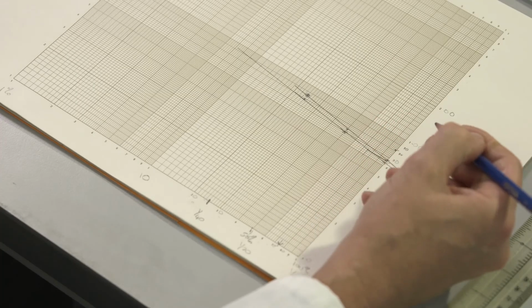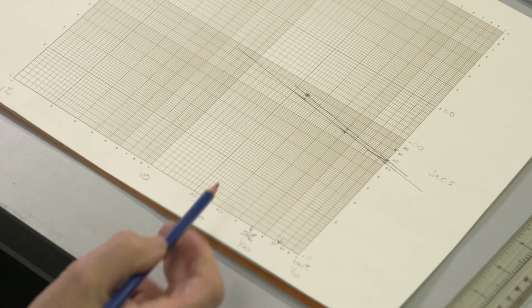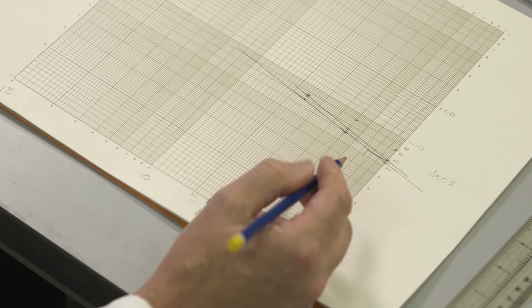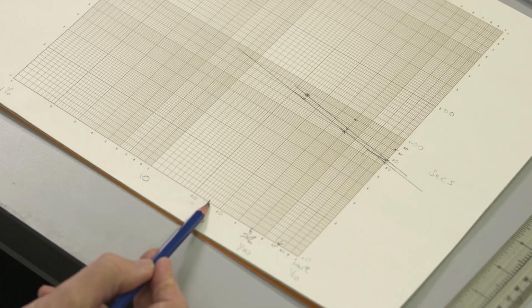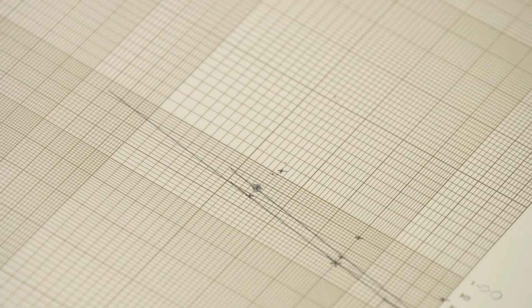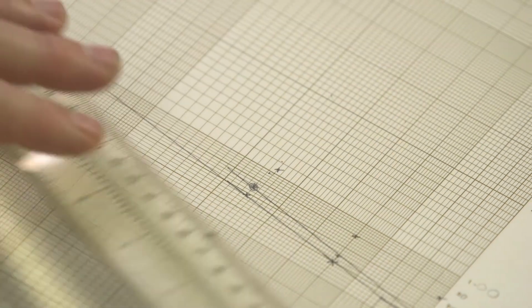Patient number 1, 1 in 10 dilution. On the 100% line, clotting time 81.5 seconds. Here. 1 in 20 dilution, 89.5 seconds. Here. 1 in 40 dilution, 104 seconds. So we now have the 3 points for the first patient sample.